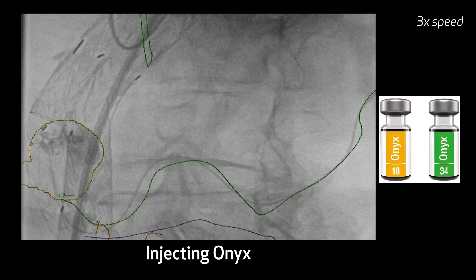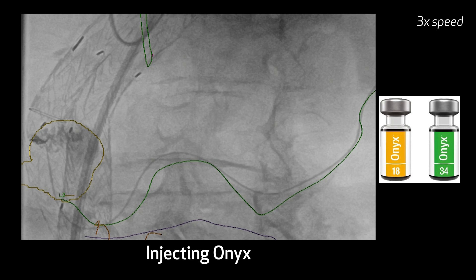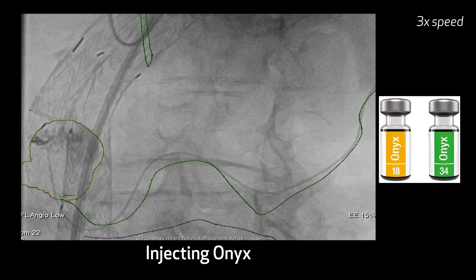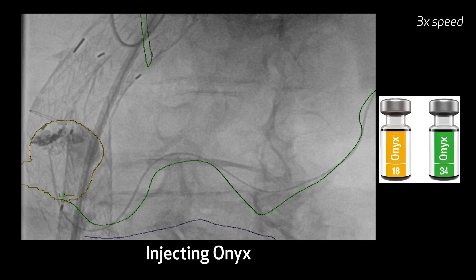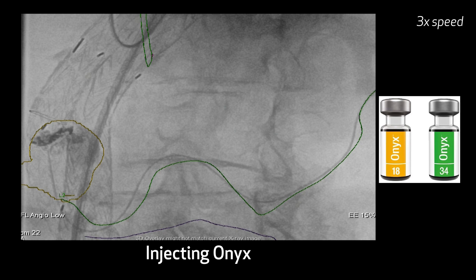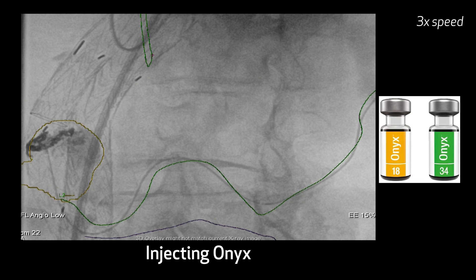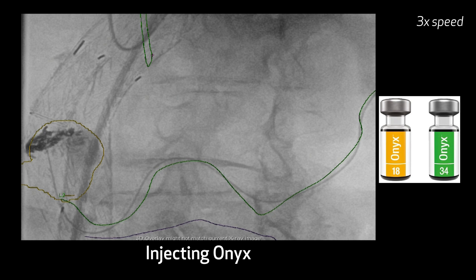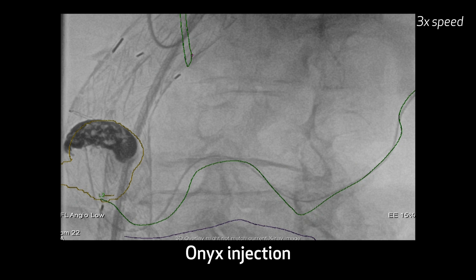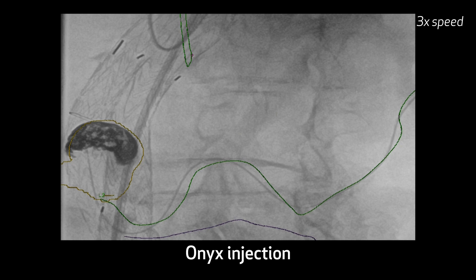You start off by flushing the catheter with DMSO. You've got to know what the volume of the catheter is — fill it with DMSO, and then we can bring in ONIX. In this case we're using ONIX 34 — the number relates to the speed of polymerization. So we don't really want it to go too far. Slowly injecting it — we've speeded this up a little bit. It's a slow process injecting ONIX. What you're watching for is any evidence of refluxing back down into the IMA or going out too far into other lumbar arteries, especially going towards the spine. You can see the spinal cord is posterior here, so you can keep an eye and make sure that nothing is going in that direction.